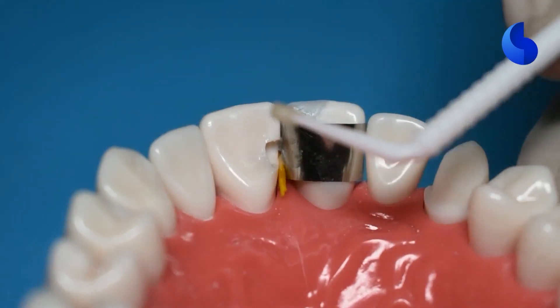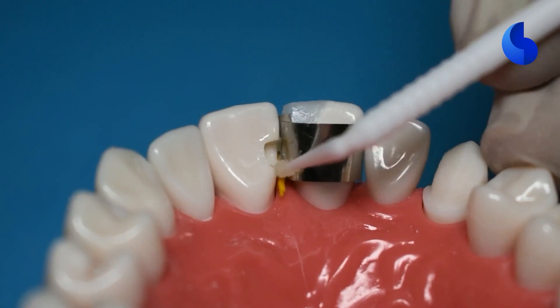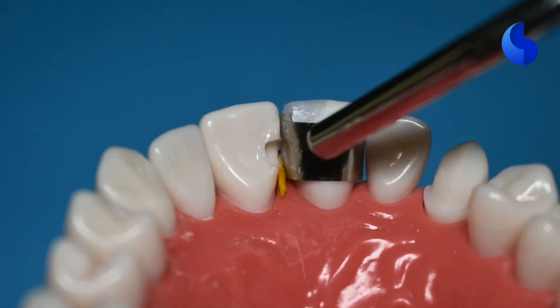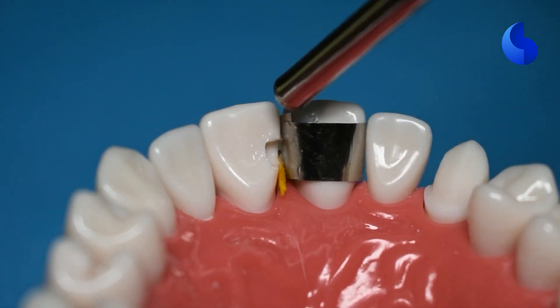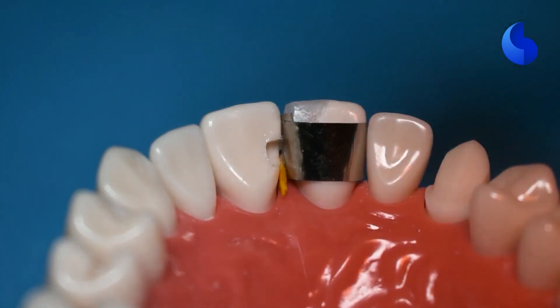This is a video where we will be restoring a class 3 preparation with composite. First thing we do is to isolate the tooth, use a matrix band on the adjacent tooth and a wedge to secure the matrix band. And remember that this does create some space between the two teeth.